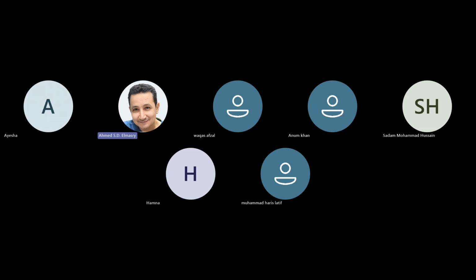And if you remove the intra-aortic balloon because of some incident or accidental rupture, and your patient is not ready to have the balloon removed, I think it's wiser to keep the sheath, remove the intra-aortic balloon and introduce a new balloon through the old sheath. This would be more practical instead of making a new puncture, which might be complicated by hematoma or bleeding. In an emergency situation, it will be very beneficial.